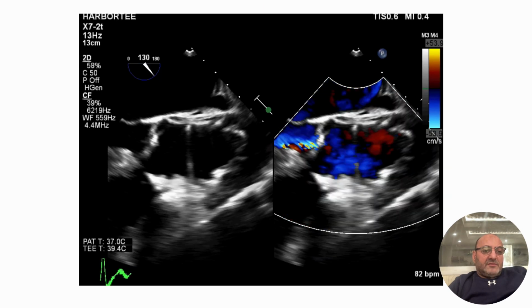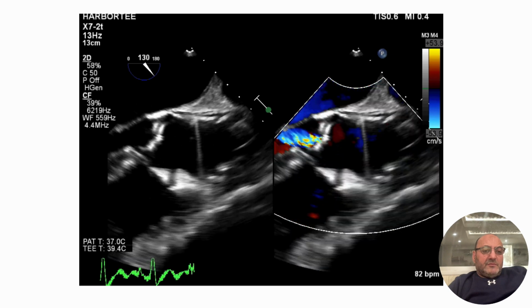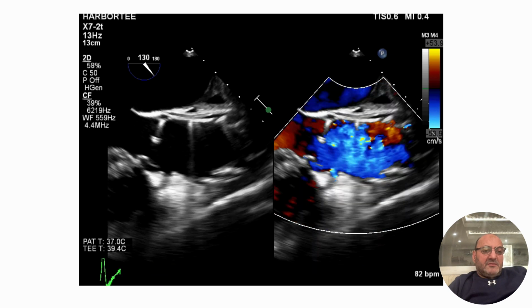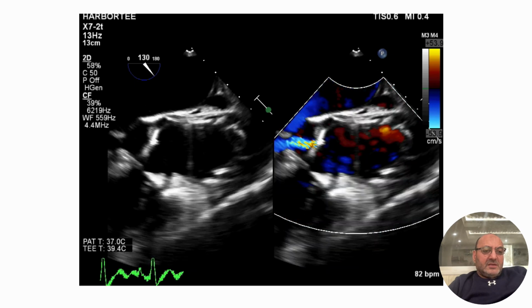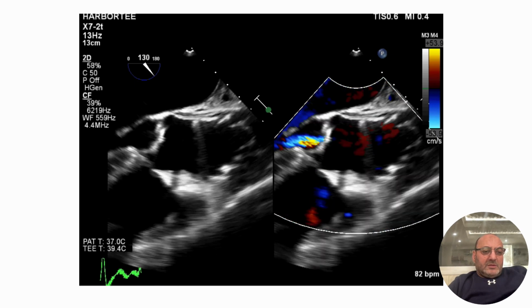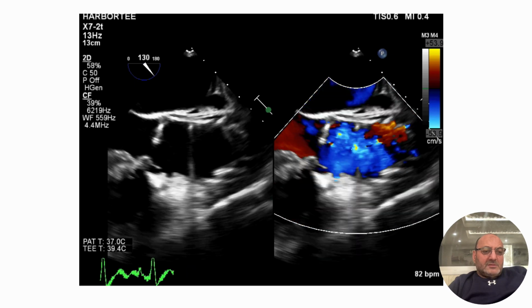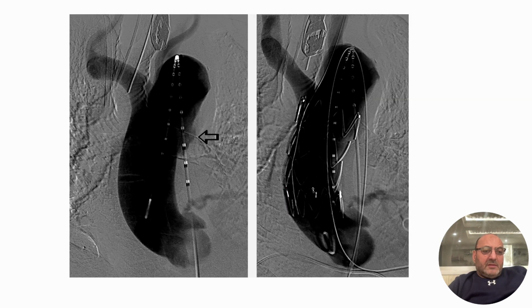And look, this is after the stent was placed. You see the flap is improved. The valve has no regurgitation, or a little bit of regurgitation, but it requires a lot of skill to place the stent adequately without a problem, as well as, like I said before, a team. And that case was one of the first cases.